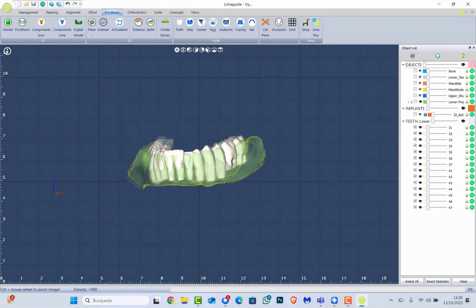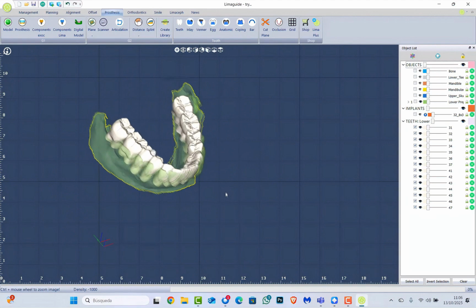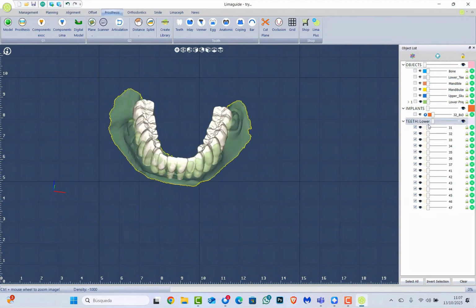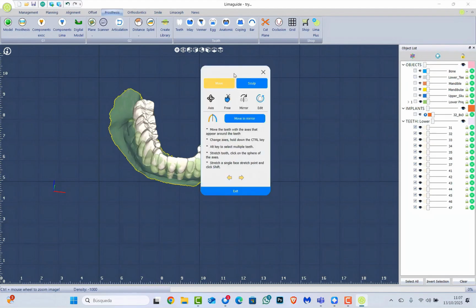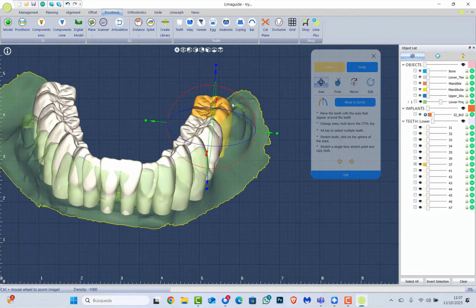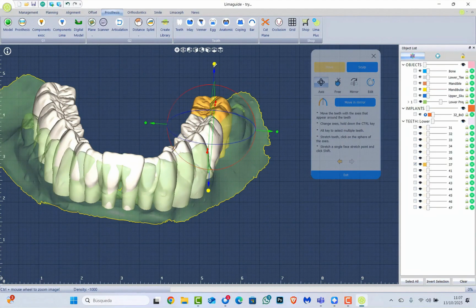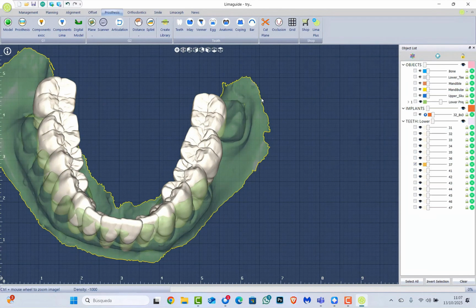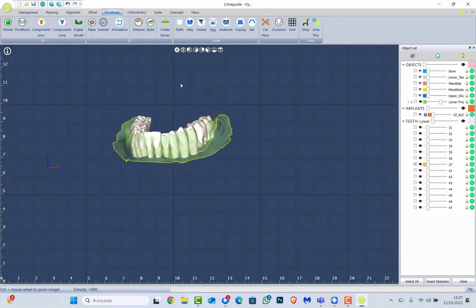So as you can see, it is basically that easy to create a teeth library with Limaguide. And now the software finally will be able to recognize the teeth, and I'll be able to use this tool to move and modify each tooth. So basically, that's it. It's that easy to create our personalized teeth libraries.